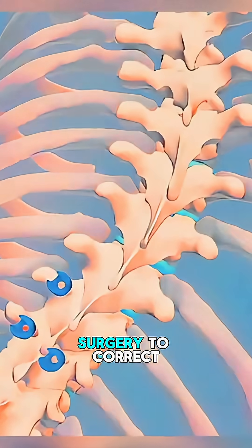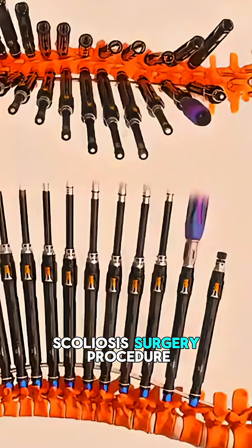Do you know how doctors perform surgery to correct a curved spine? Let's explore the scoliosis surgery procedure.